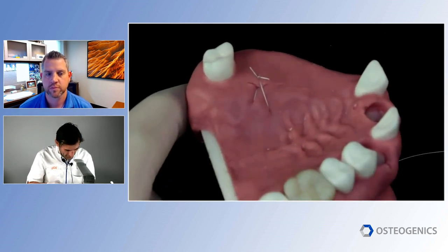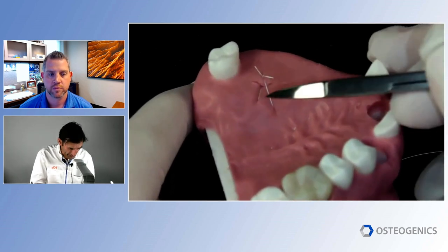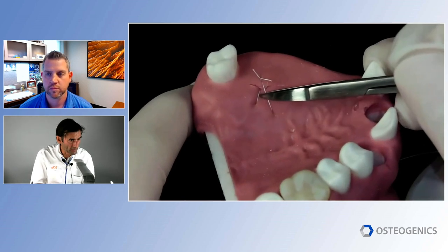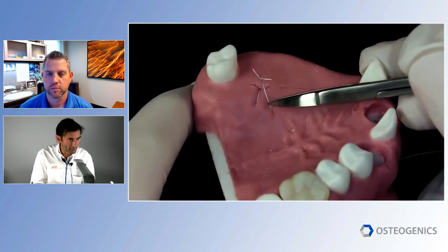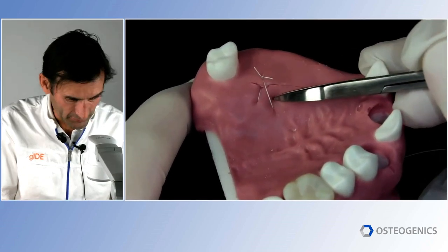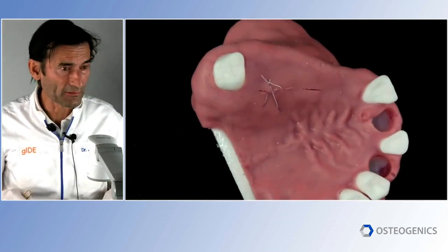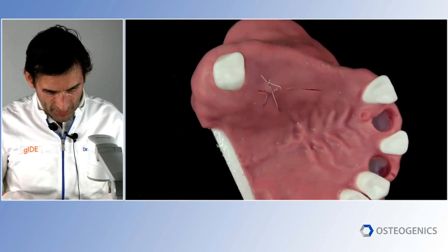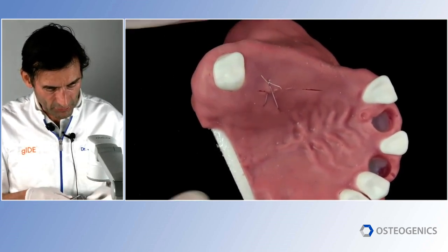And you can see how I'm pressing. The silicone shows it pretty nicely, how this flap is pushing down, right? It's pushing down. And this one is moving the margin down. So it stops the bleeding from internal and it stops the bleeding from external. So that's really good. This will probably stop the bleeding already in a patient who's bleeding. But if not, then you just put some pressure with a gauze for like a minute. And then you go to your second suture.